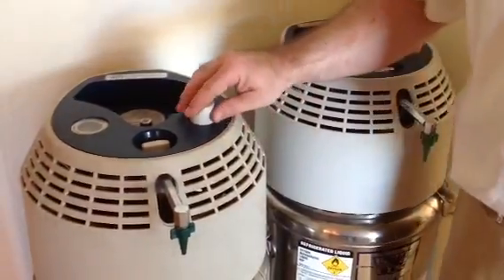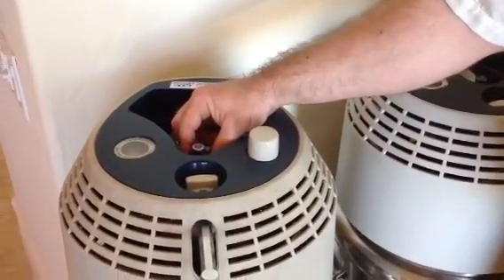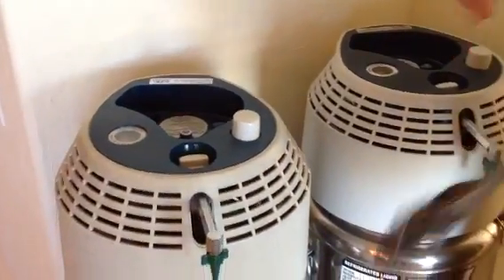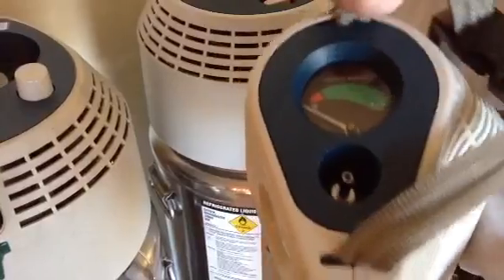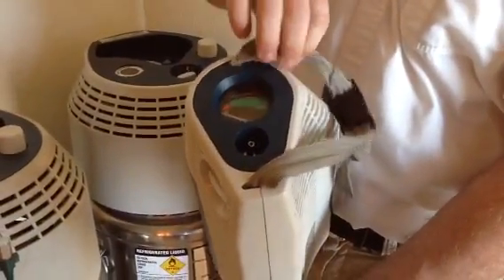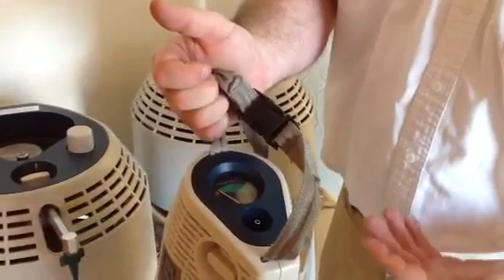The only other movable part here is this push button, which helps you remove the portable from the fill connector. Here we have our portable, and it is much the same way — there is a contents gauge, which is actually a weight scale that you have to hold on to the top strap closest to the top of the gauge and let it hang and dangle, and that will give you a proper reading of what's inside the portable unit.